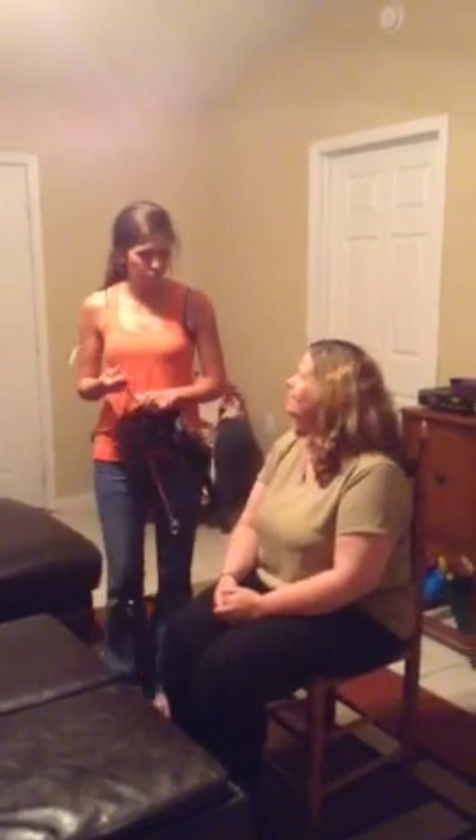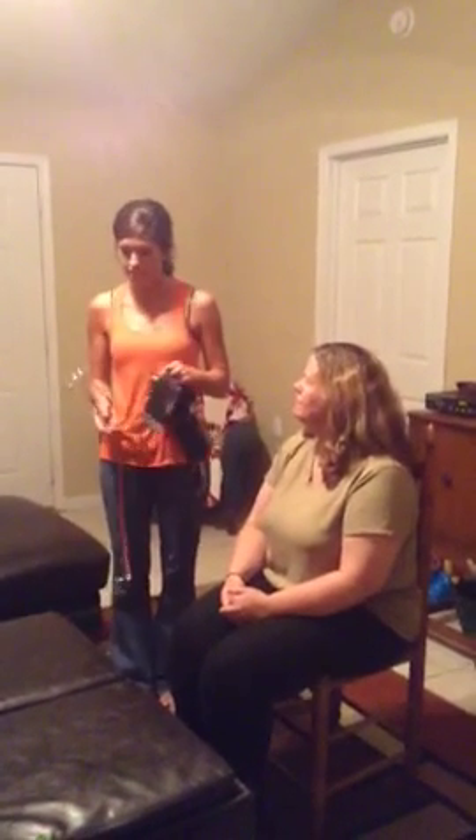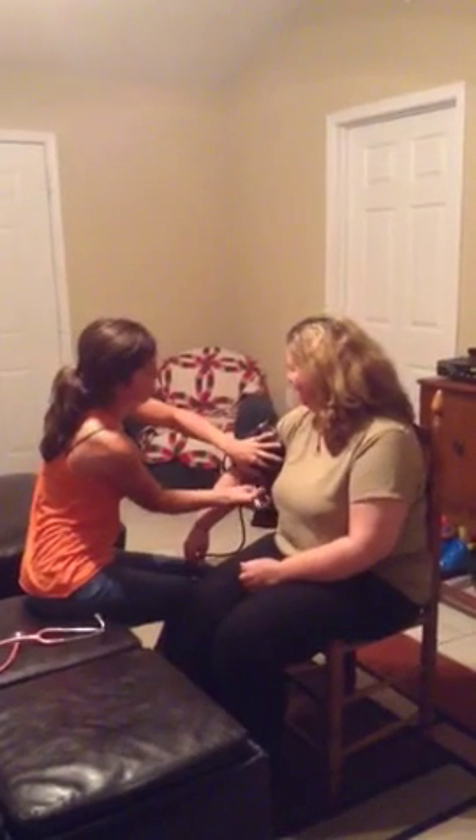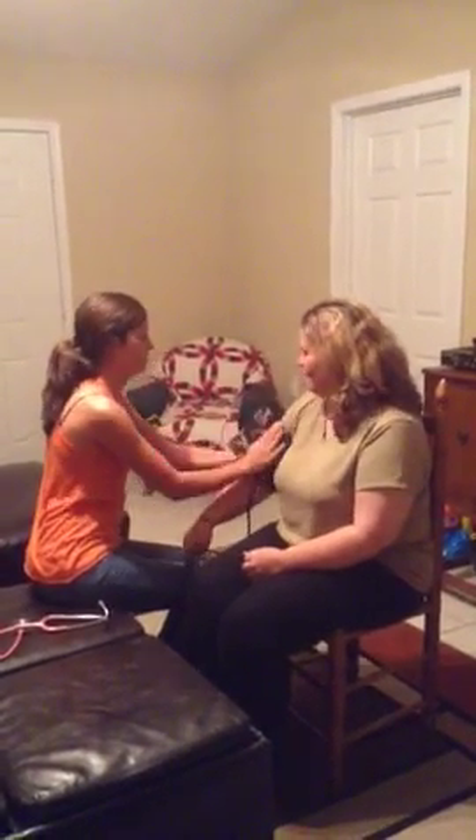Once your patient is in their seat, you will put the blood pressure cuff on the right arm. You close this dial by turning it to the right, and then you pump it up to between 160 and 180.